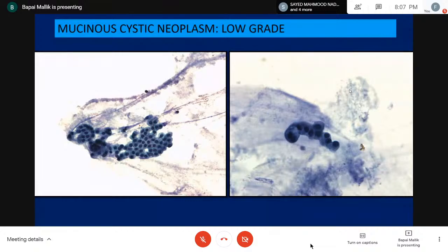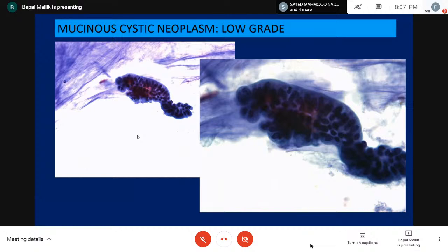So this is a low-grade mucinous cystic neoplasm, as you can see over here. It's mucinous with mucin, but the cells are pretty uniformly placed. Nuclei look to be a little bit hyperchromatic, but it's okay. Maybe because of the way the picture has been taken, there are sharp nuclear outlines, not a very high NC ratio. It's pretty okay. I would call this a mucinous cystic neoplasm, low grade. Another low grade, a little bit of an overlap. Again, very sharp nuclear outline. The nuclear cytoplasmic ratio is not raised. Pretty good maintenance of polarity. This is just kind of an overlap, low grade.